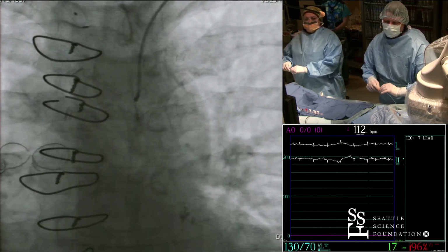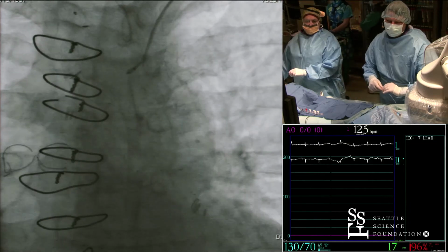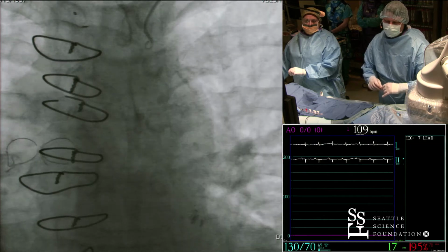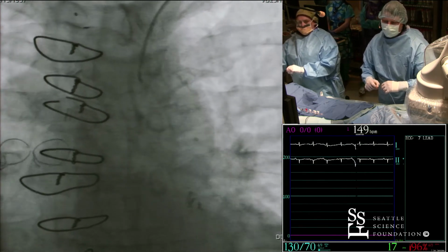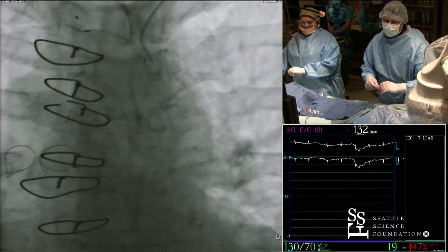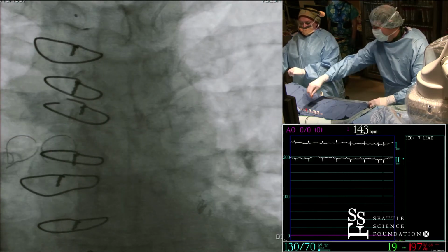So is that the Rosen wire you're using, John? Yeah, this is the Rosen wire. Have you tried Merit? They make a baby J that is softer and it's not hydrophilic coated. I don't know if the hydrophilic coating is something that... Go back up a little bit more, John, and rotate very slowly. I think you've got it right there. Yeah, it bucks out every time I do that. That's the thing. It's going to be faster if I just do the Rosen glide.